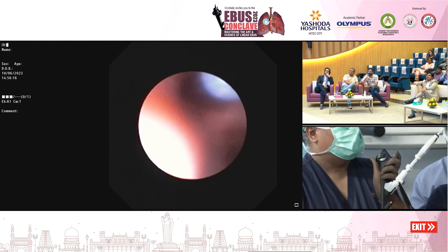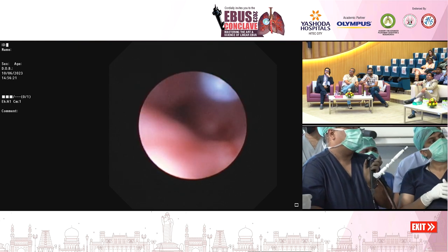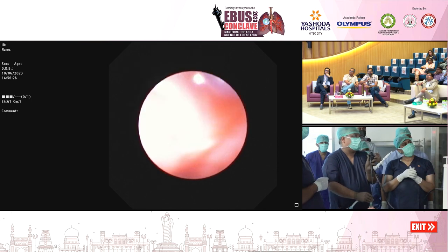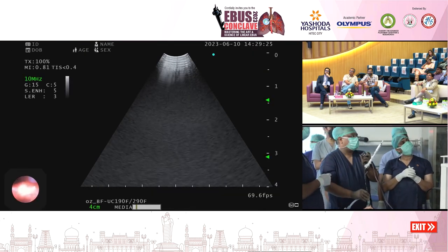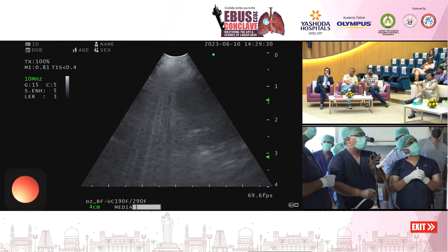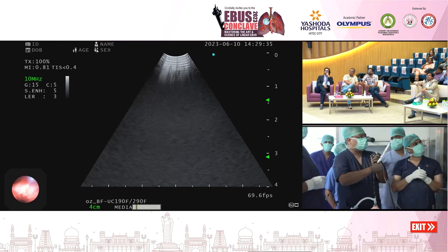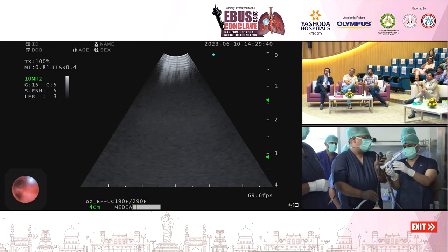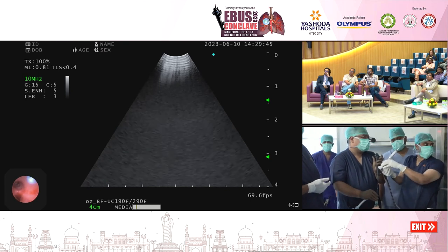A little more outside than what you would like, but it's okay. The scope becomes a little less flexible once the sheath and needle are in situ. So one might have to use a balloon to make a contact if required. So sir, this is the 190 scope we are using. Unfortunately, the balloon that is available with us does not fix snugly to this scope. So we have not put a balloon for this scope as of now, and Olympus doesn't recommend the use of a balloon with this particular scope.